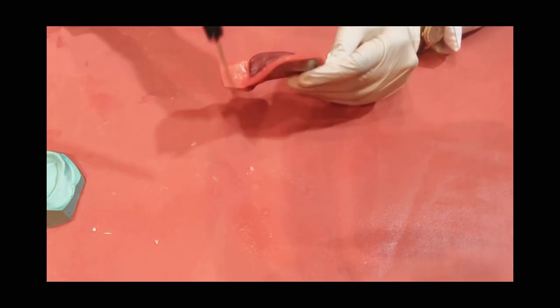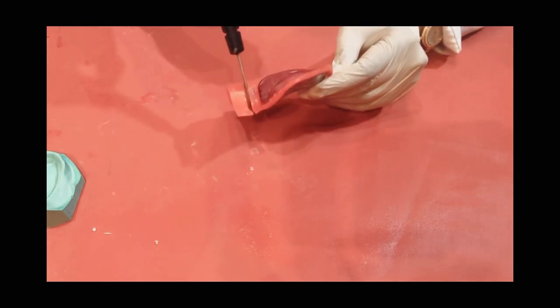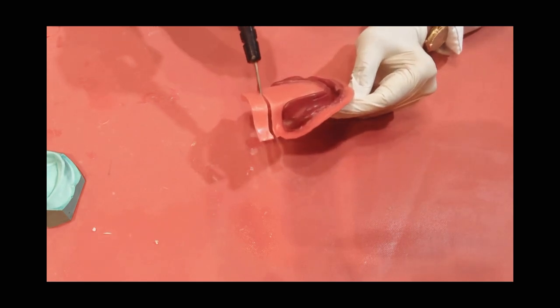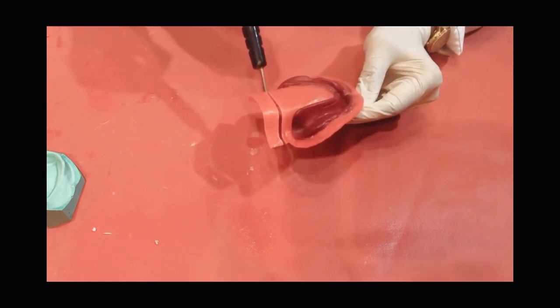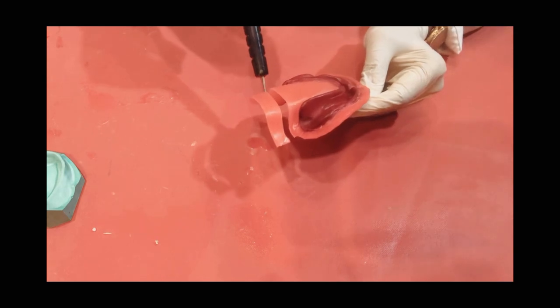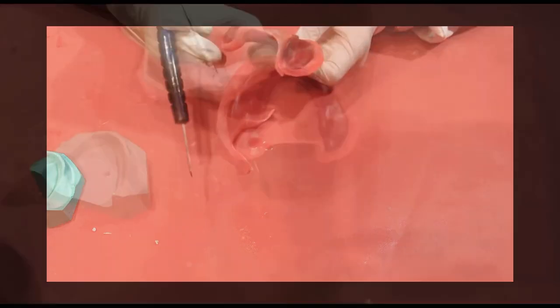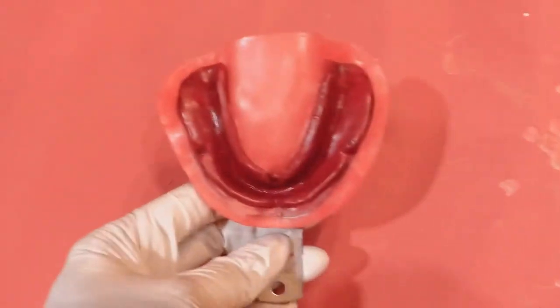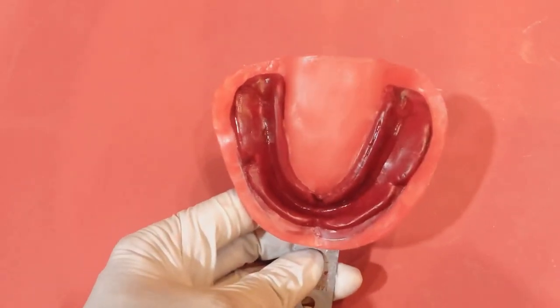No worries if you don't get it perfect the first time. You can see that the tongue space wax is extending beyond the extent of beading kept at the retromolar pad area. Remove the excess with a heated wax knife. Now we are done with beading.